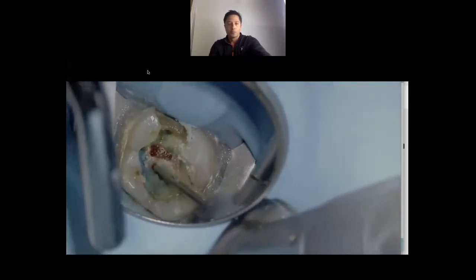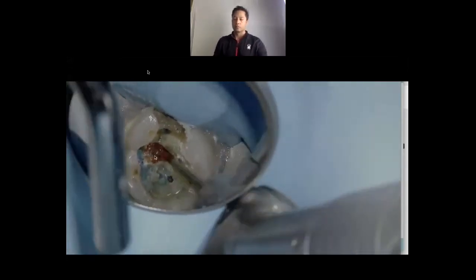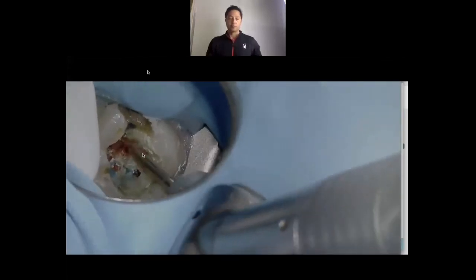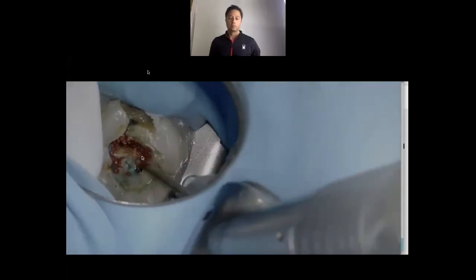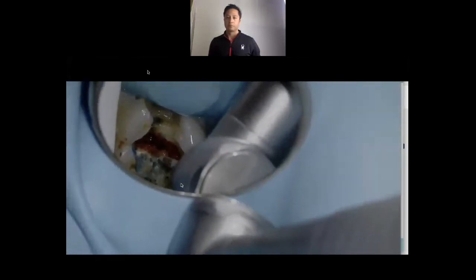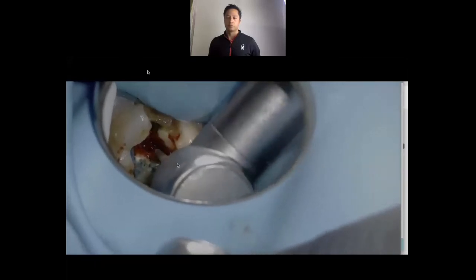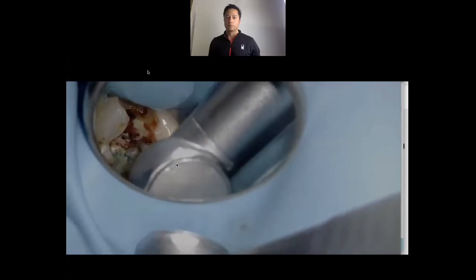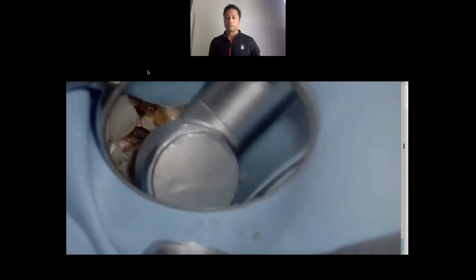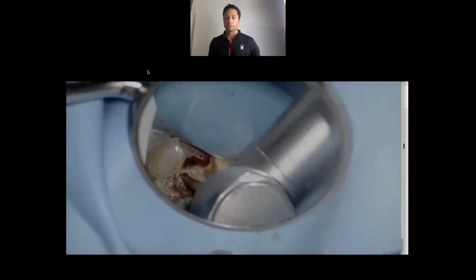Literally what I'm doing is unroofing that pulp chamber. Moving towards where our mesial buccal orifice is going to be, and now unroofing where our distal buccal orifice is going to be. I'm going to still try to keep this as conservative as possible, but we need to be able to clean and shape effectively. We've elected to do the pulpectomy in this case because she walked in with symptomatic irreversible pulpitis and symptomatic apical periodontitis.